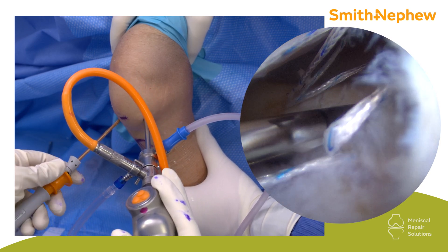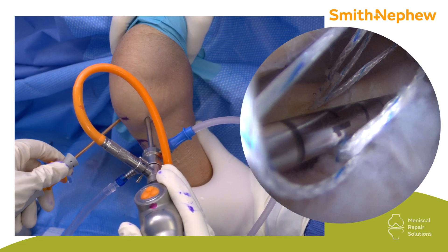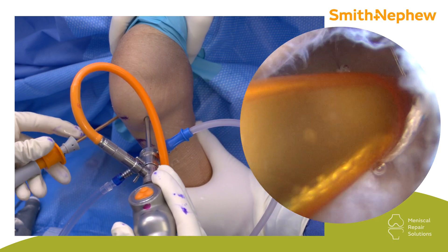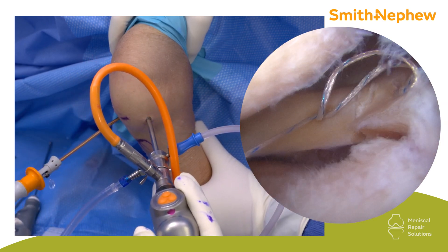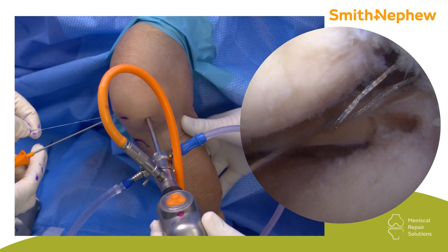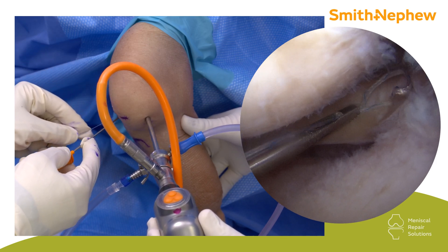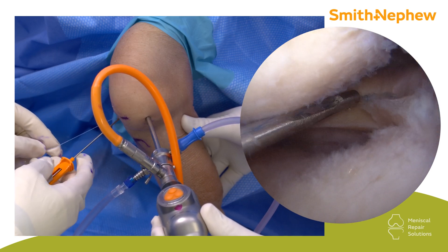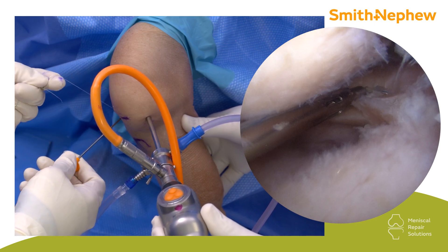For your second T, you're going on the soft tissue part of the root here. Again, you push through — mind your trajectory. I put tension on my suture, I slide the nut pusher down, I go straight on to the knot. The key is to just take the slack out — don't over-tension it. Do not over-tension. Take the slack out — that is it, that's all you need to do. Now I hold tension on my suture and cut. And that's it.